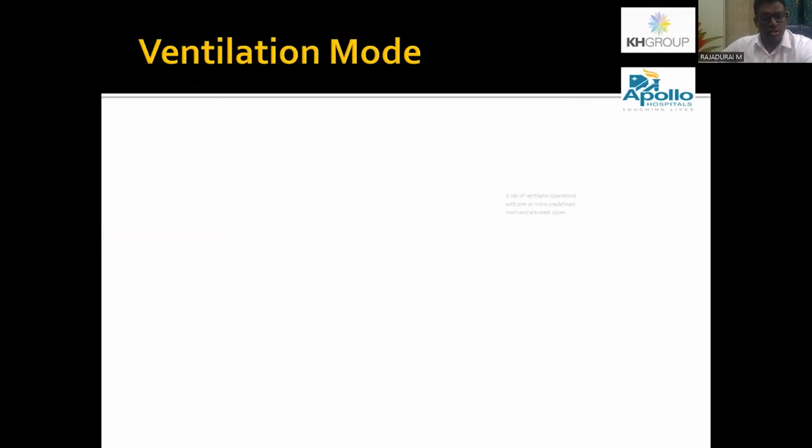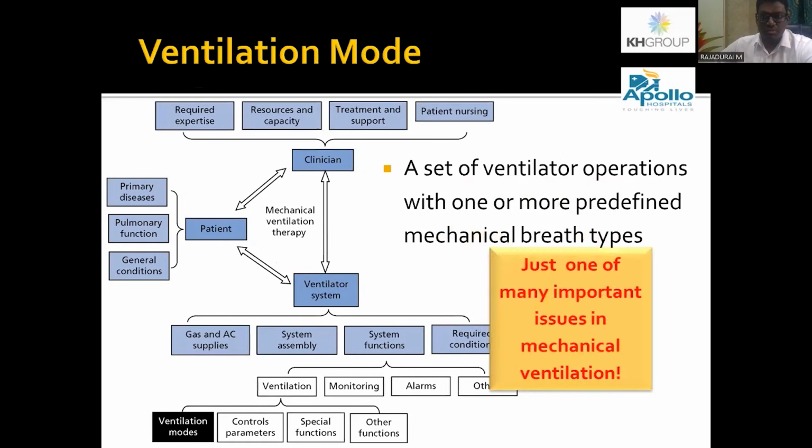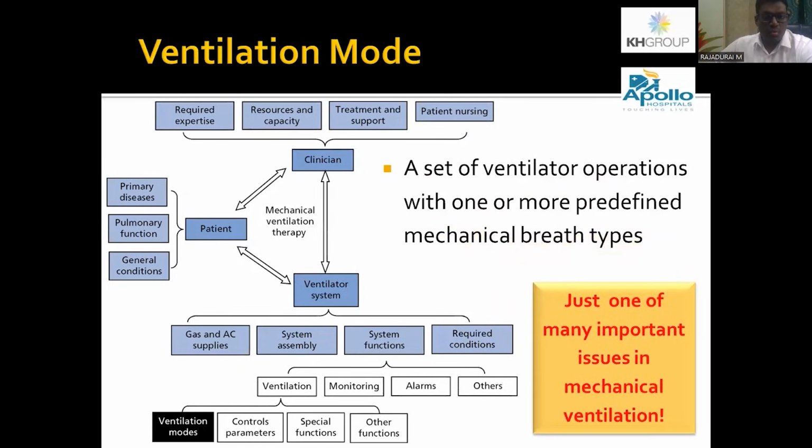Which mode to choose? I have seen so many of us approach with a prefixed ventilator mode before we have even seen the patient. As has been clearly mentioned, mode is just one of the many important issues during mechanical ventilation. Ideally, a mode should be decided based on the patient.